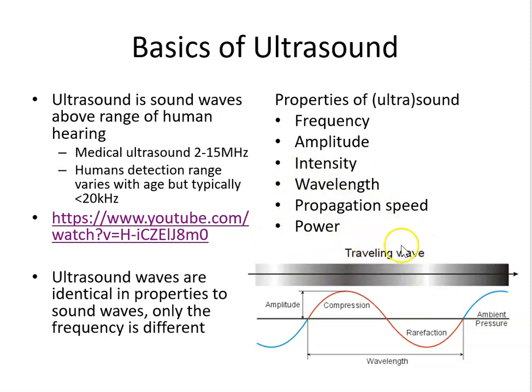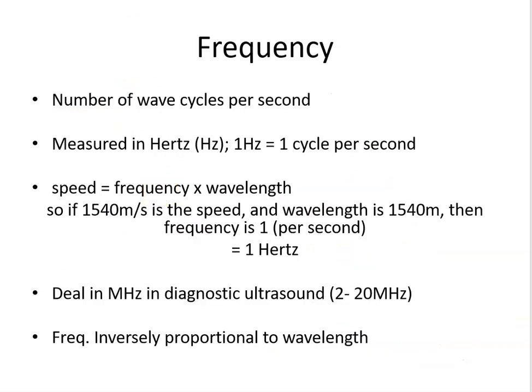We'll talk about speed and power as well as we go through this session. So firstly, frequency, the number of wave cycles per second. So this is hertz. So 1 hertz is 1 cycle per second.